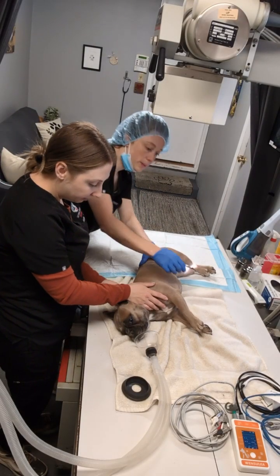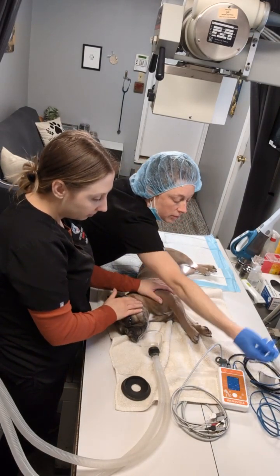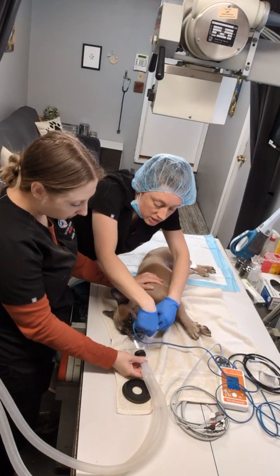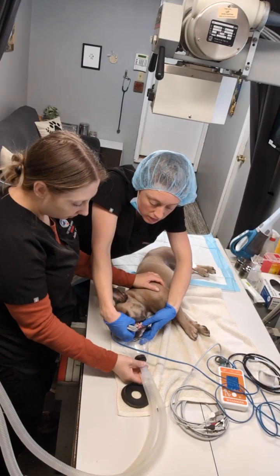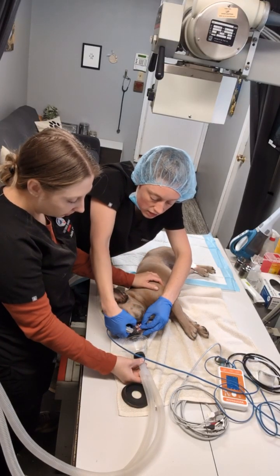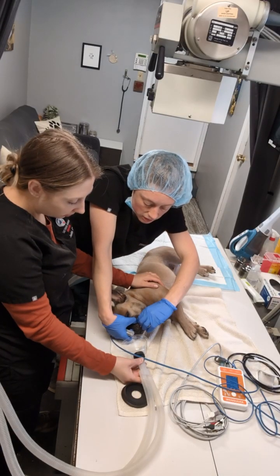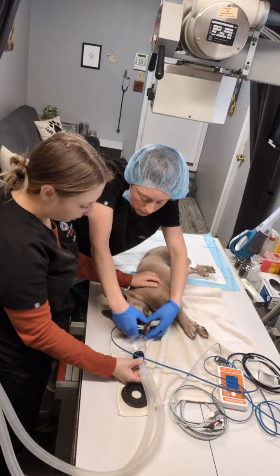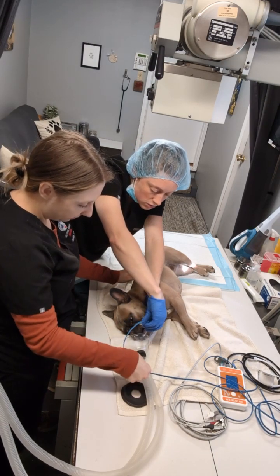Okay, so to monitor a patient, we've got one device that has a lot of different monitoring systems on it. So we have our pulse oximeter that helps to measure the oxygen saturation of hemoglobin. This just has an electrode that can go on the tongue, it can go on the ear, it can go on the vulva. I'm hoping to put it on her tongue. Maybe ear too. Or it can just go on the lip.